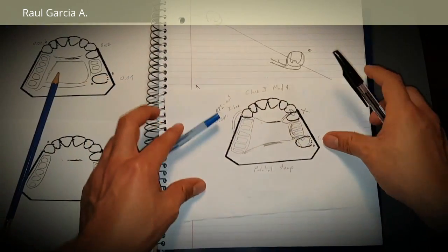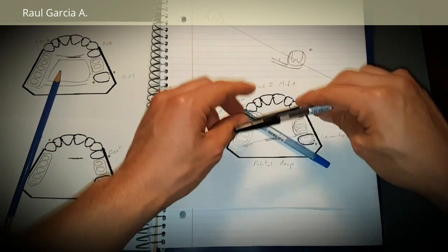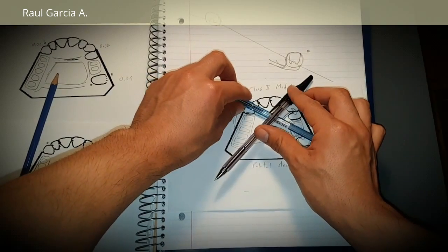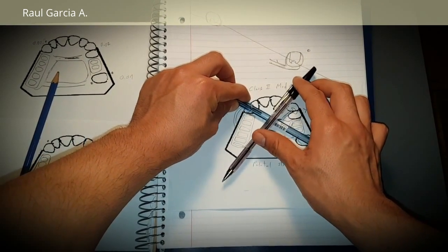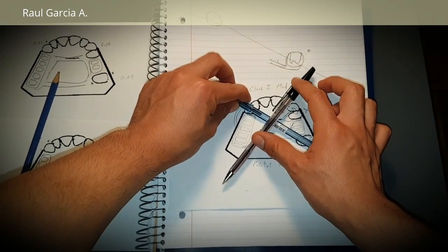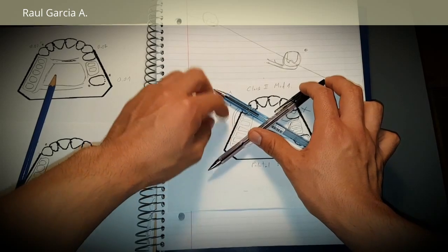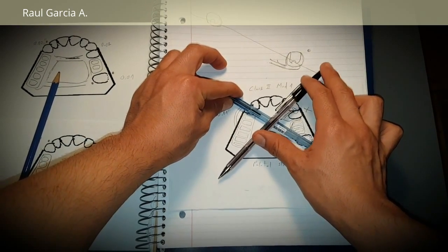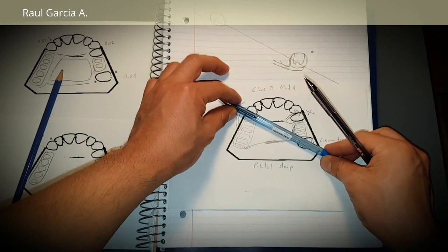The fulcrum line is going to tell you how the RPD is going to function when the patient is biting. So in function, in masticatory function. So it's going to do it like this, because this is just mucosa. So the patient bites here and it goes up. See? Okay. So that's your fulcrum line.